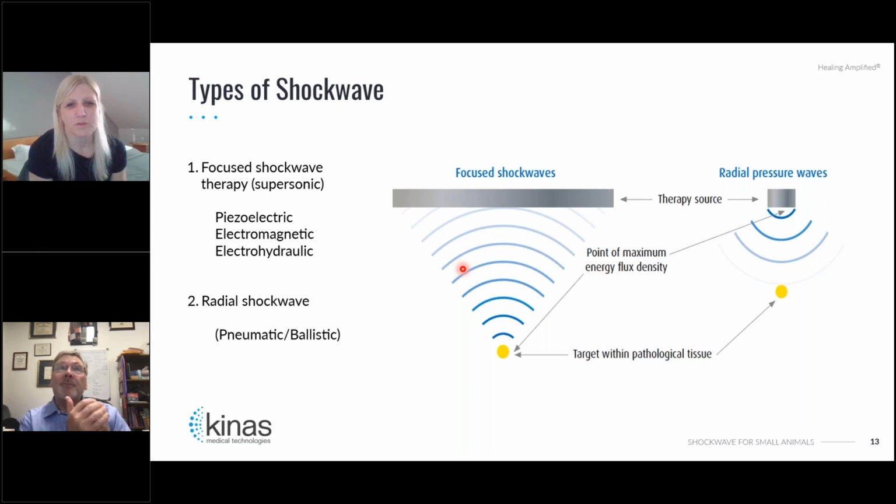I would go to those parts where you can palpate and see where the ridge of the plate is. I would also always go over the bony part and never just hammer the plate. If you know where your plates are, and if you palpate them, you can just go around. And there is some literature in the human field, I think, about total hip replacement and how you can help the bone to densify a little bit. So I think we're pretty safe.